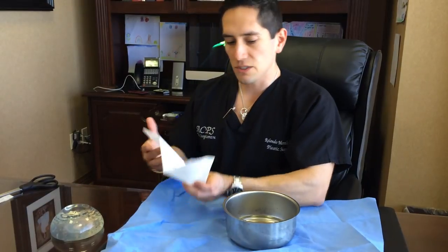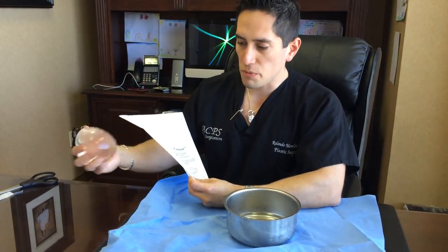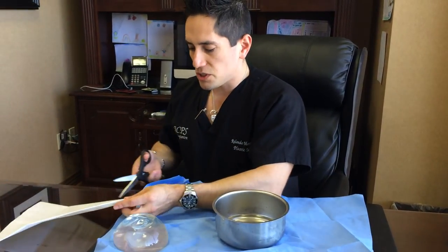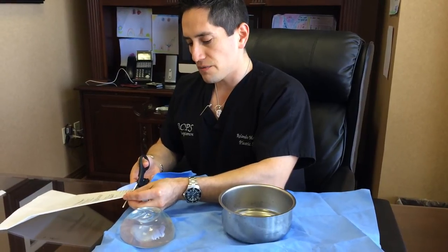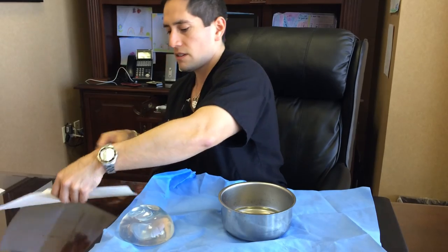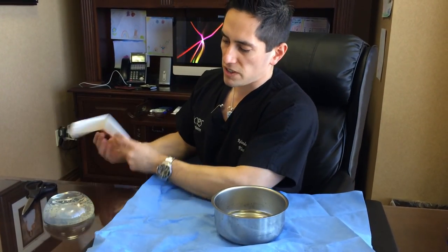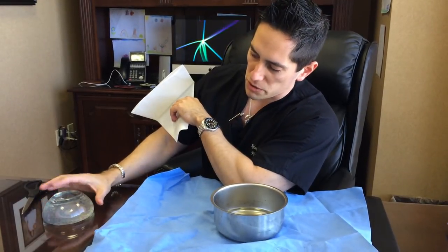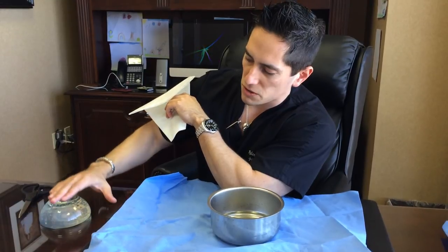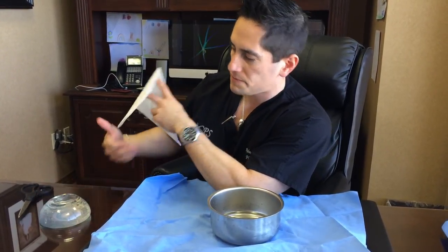So this is all done sterilely. This comes in sterile for surgery. The implant's brought into the operating room sterilely, and this is just for demonstration purposes. What you do is cut the funnel based on the size of the implant. This implant's 430 cc's. It's an ultra high profile implant, which means it's a little bit taller than most implants, and the base, or the footprint of the implant, is smaller, so the volume goes up. And so in the body, it looks more like that.